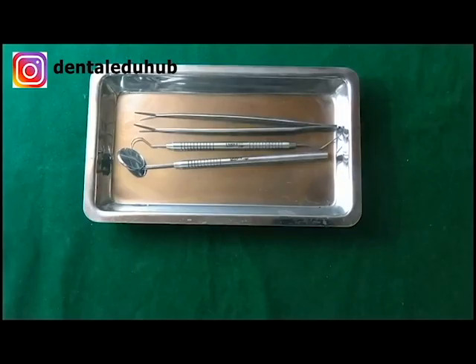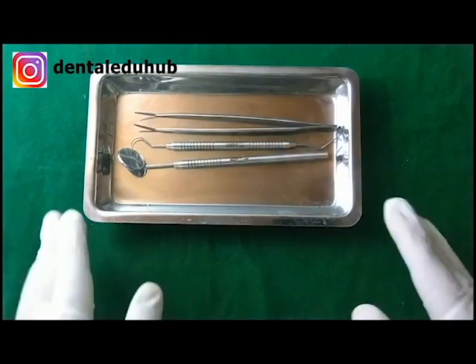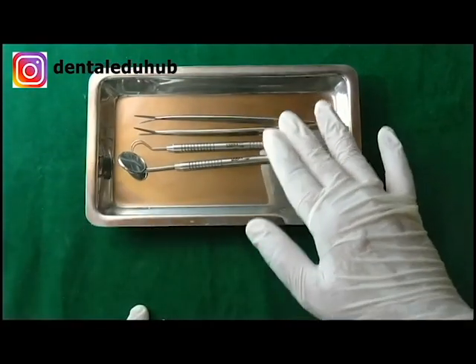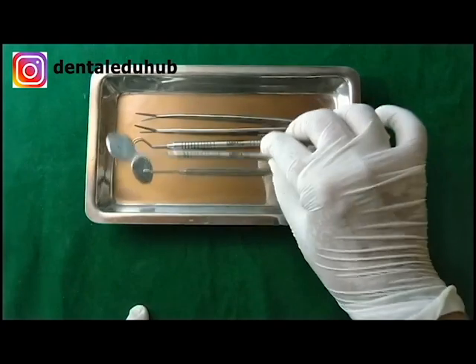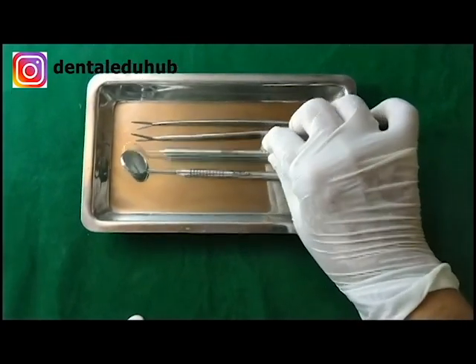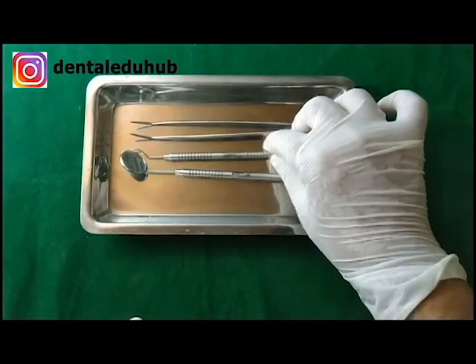Hello everyone, today I am going to explain about the basic dental examination instruments. This is an examination tray. In this tray there are three basic examination instruments: this is the mouth mirror, this is the explorer, and this is the tweezer.